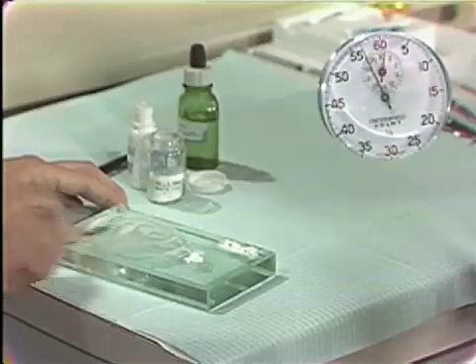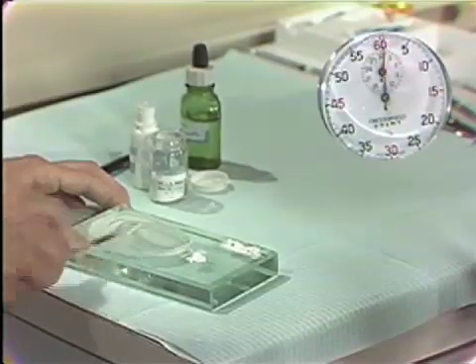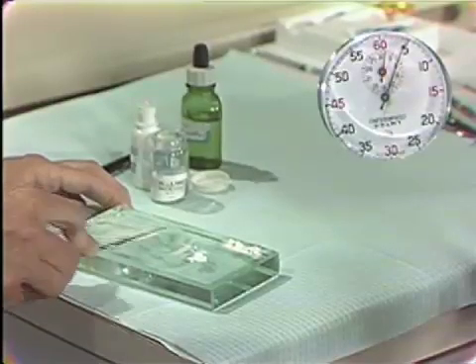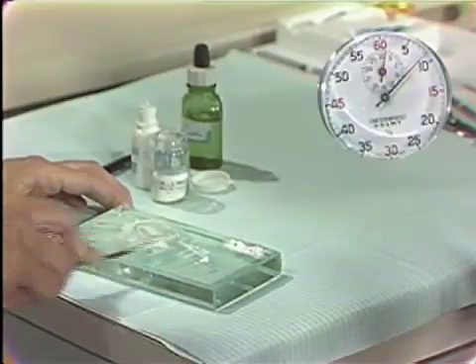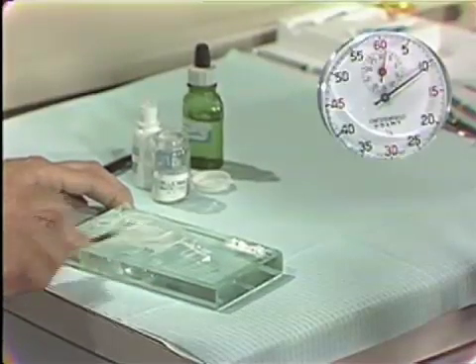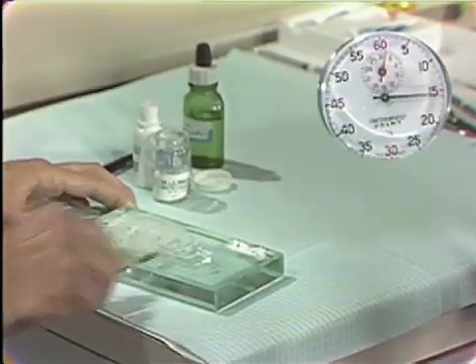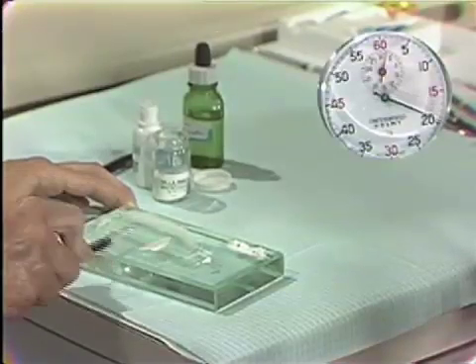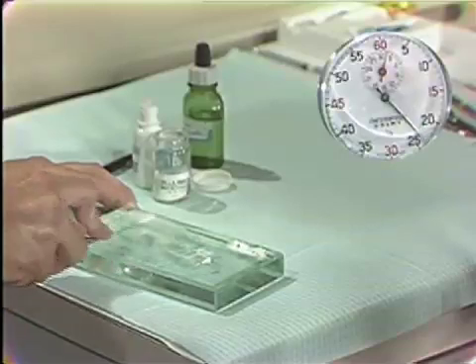Notice the finger that is holding the spatula — it is blanching a bit. This is putting pressure upon the spatula so that we are getting a good mix. At the end of the fifth increment, the operator should test to see if it is at primary consistency, because we are mixing to a consistency. The material should draw up about an inch to an inch and a half. Notice it did it.